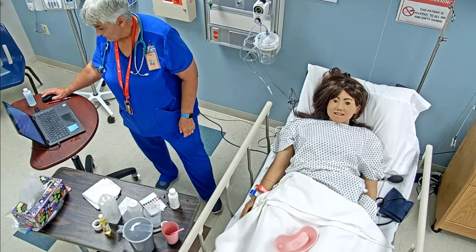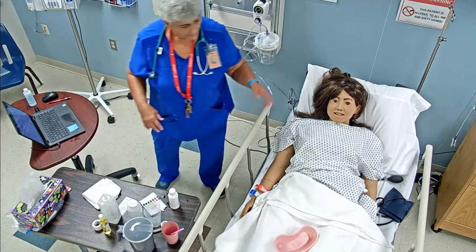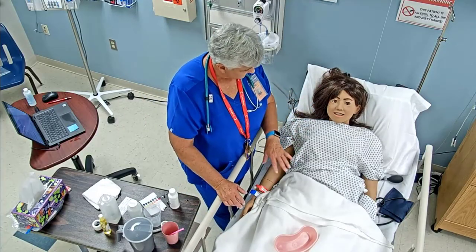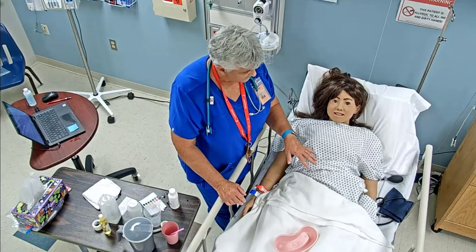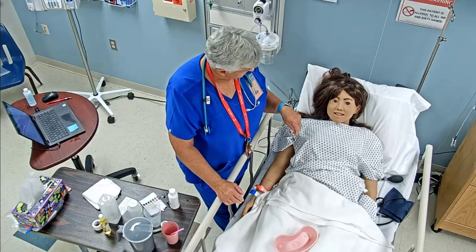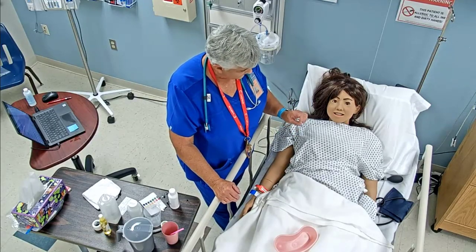We did our abdominal assessment, so we kind of go back through. We did our abdominal assessment, that we removed it, that we checked the marker, we checked for the gastric acid.